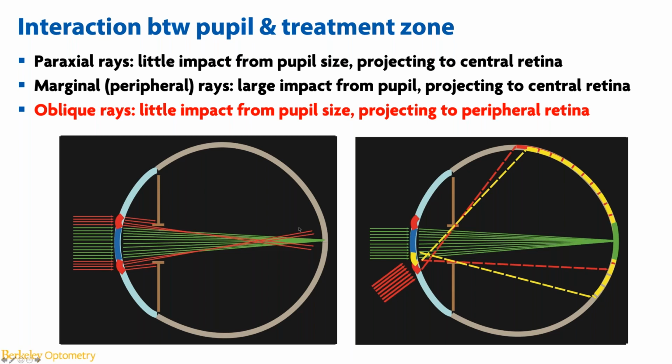huge difference. But if you are a firm believer that it is the peripheral myopic defocus that's the anti-myopia dosage in Ortho-K, you don't actually need to push too aggressively in pushing this paracentral steepening area to be inside the pupil, because having it shifted inside has pretty limited impact on how far away you can project to the peripheral retina or the extent of this overall projection.